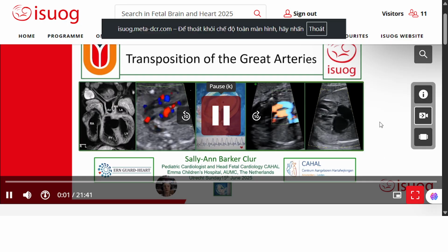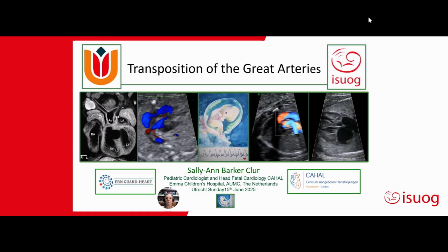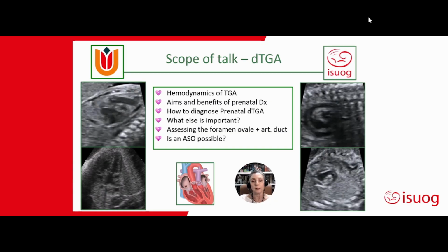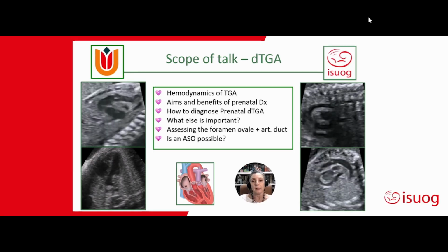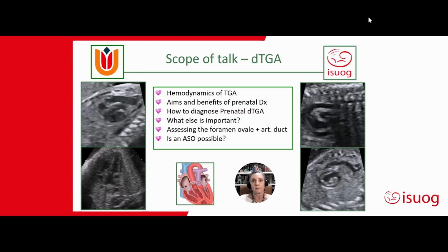In this talk, I'm going to be telling you about fetal transposition of the great arteries. I aim to assist you to make a diagnosis prenatally of transposition of the great arteries and to give you pointers to make an estimate of the postnatal condition of the baby.